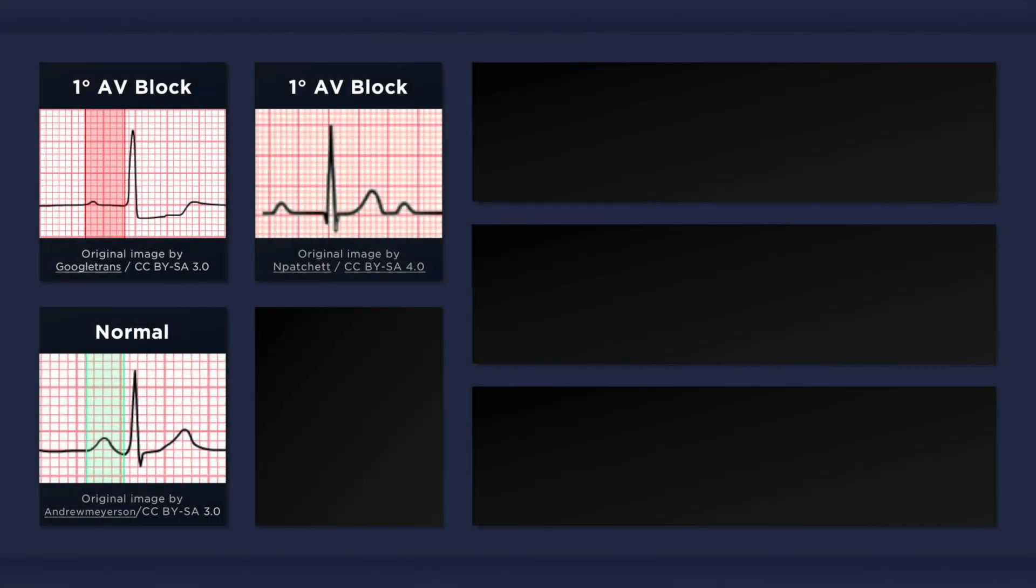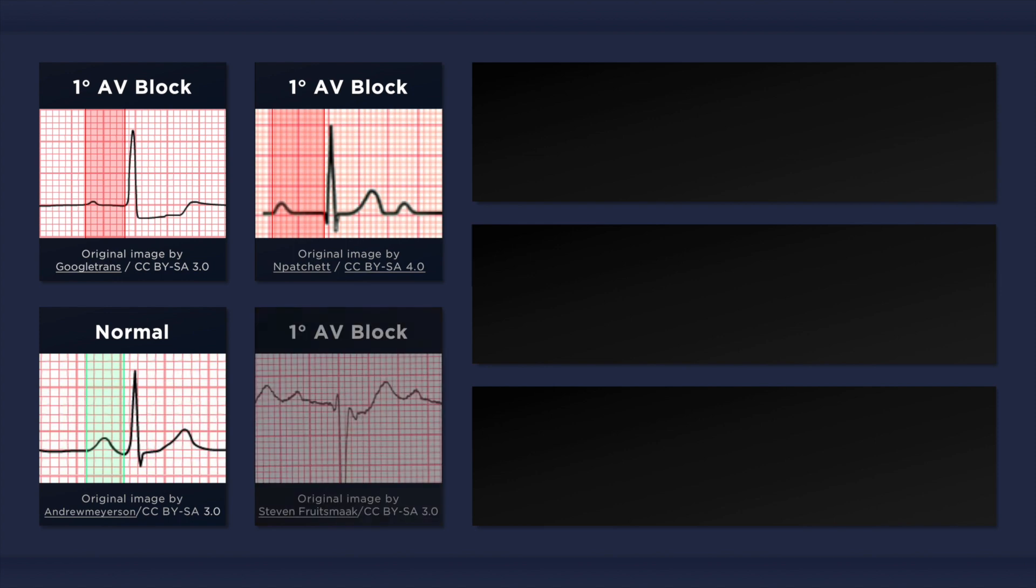Here is another example of first degree AV block. The PR interval is about 8.5 little squares in duration, which equates to 0.34 seconds. And in this new ECG below, the PR interval is about 7.5 little squares in duration, which equates to 0.3 seconds.